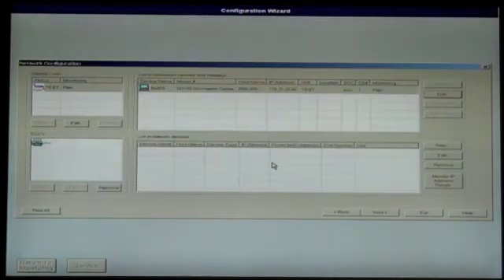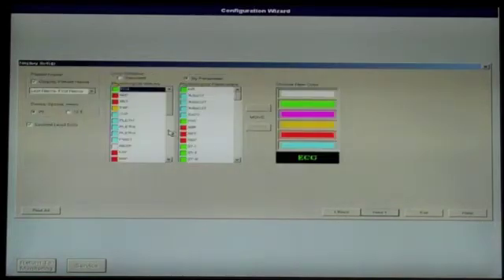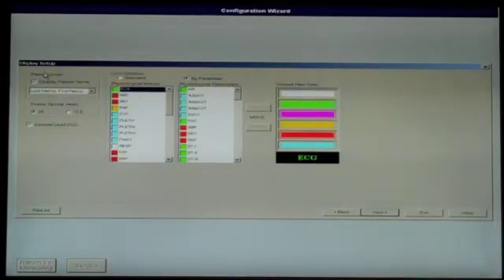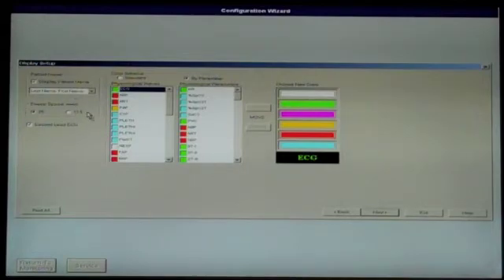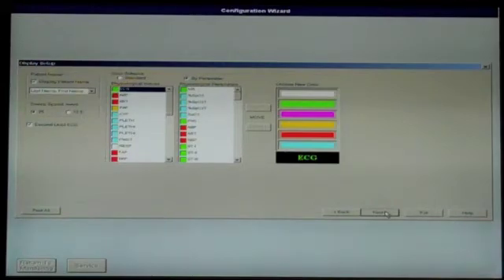At the Display Setup screen, select your desired settings for patient name display, sweep speed, second lead ECG, and color scheme. Click Next to continue.